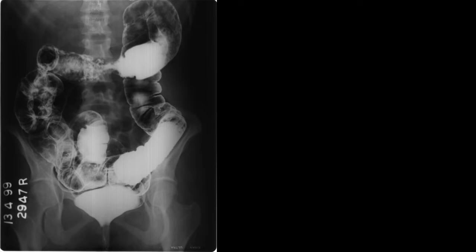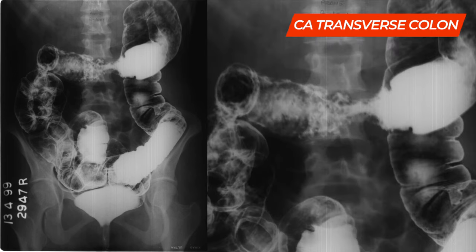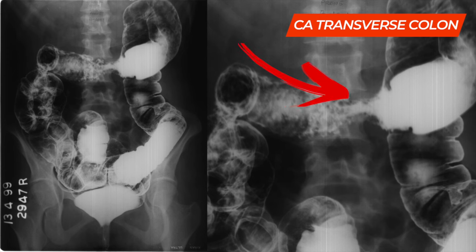In the next case, a double contrast study shows the large bowel completely opacified with barium and air. We can see a short segment stricture in the mid-transverse colon with an apple-coring effect — shouldering on either side — which again turned out to be a neoplastic lesion.